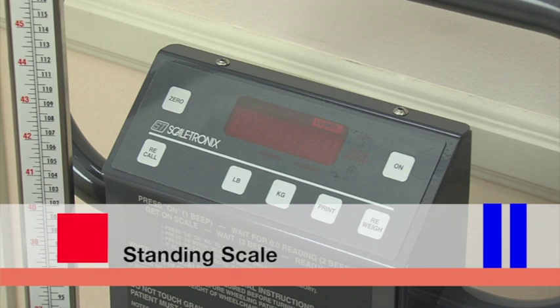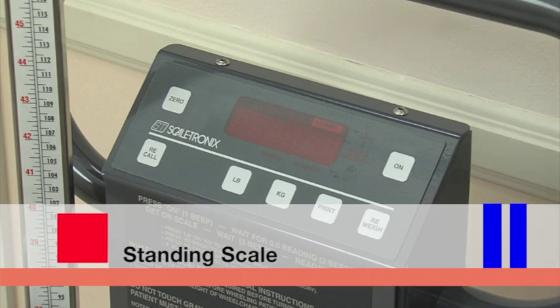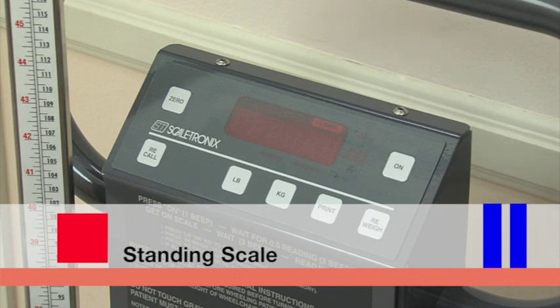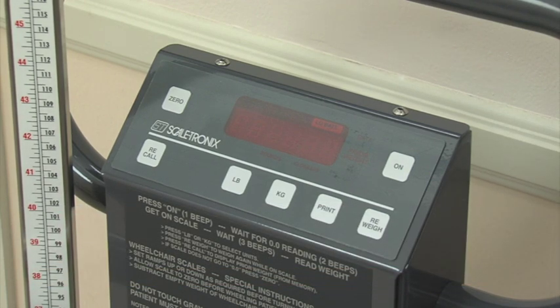If an individual is able to stand without assistance, use a standing scale to measure weight and height. Before weighing an individual, obtain the previous weight from the chart. If no previous weight is available, ask the resident what his or her current weight and height are.